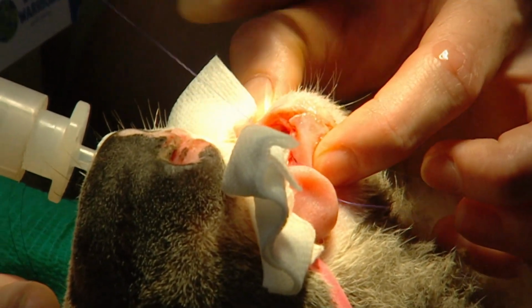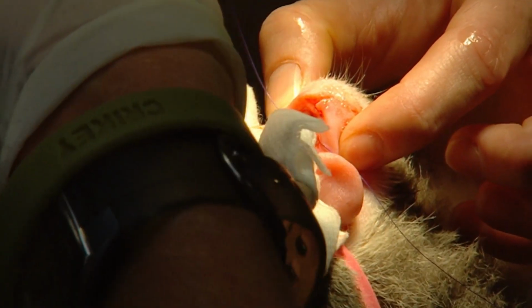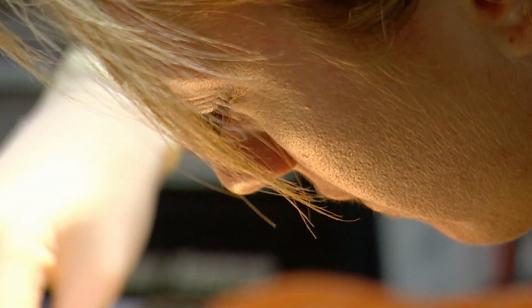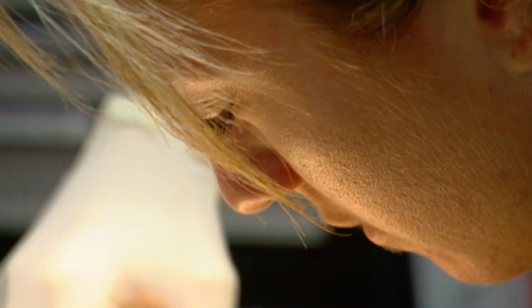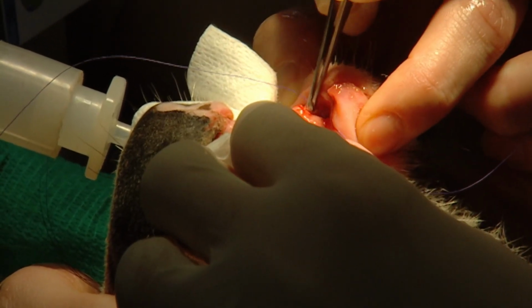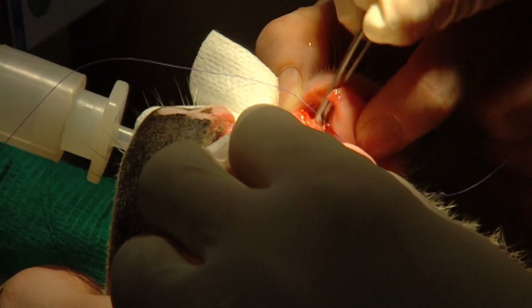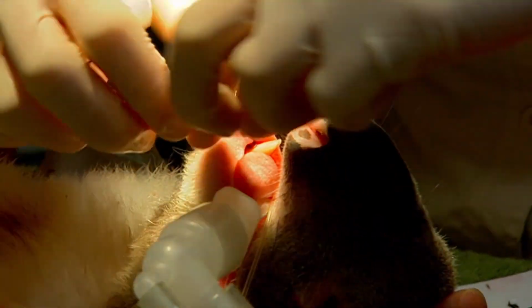Koalas eat nothing but gum leaves, and they rarely drink water. It all comes from the leaves. Amber's surgery will have to be spot on. Tough gum leaves will certainly test her stitching. This at least won't hinder him chewing on his gum leaves. It'll just more be a pain factor and ensuring that we don't get food packing into the wound. All right, we can wake him up now, I think.